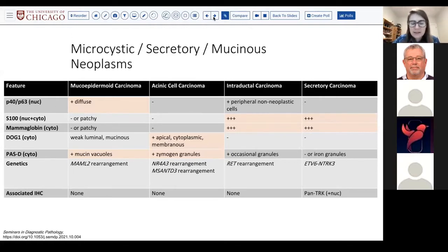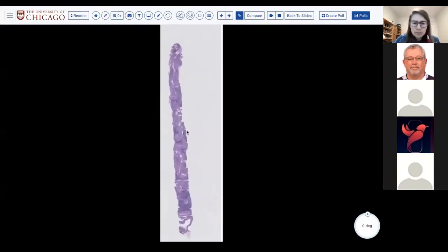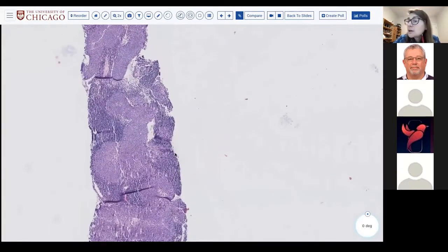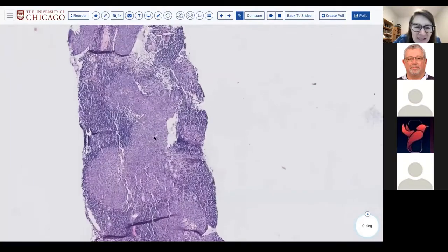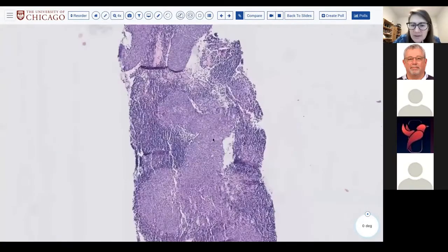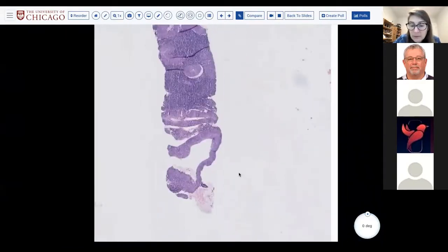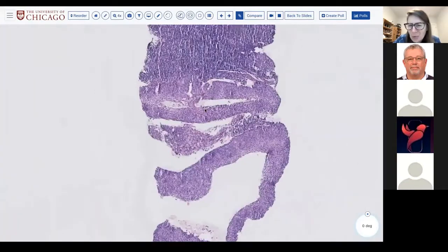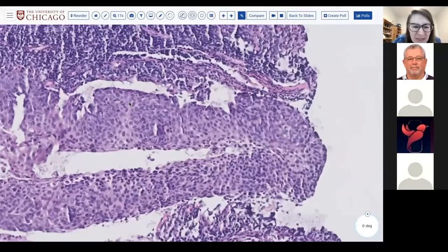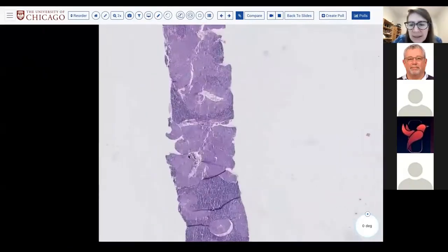So, okay, let's move on again for the sake of time, if you guys don't have any additional questions. So this was a fun one. That was a submandibular mass. And I actually see an epithelioid population with a lot of background lymphoid cells. And so are we really in the submandibular gland? Or are we in a lymph node? Or is it a Warthin tumor? You tell me. That doesn't look like a Warthin tumor, right? That's too nasty, too ugly, not oncocytic enough.